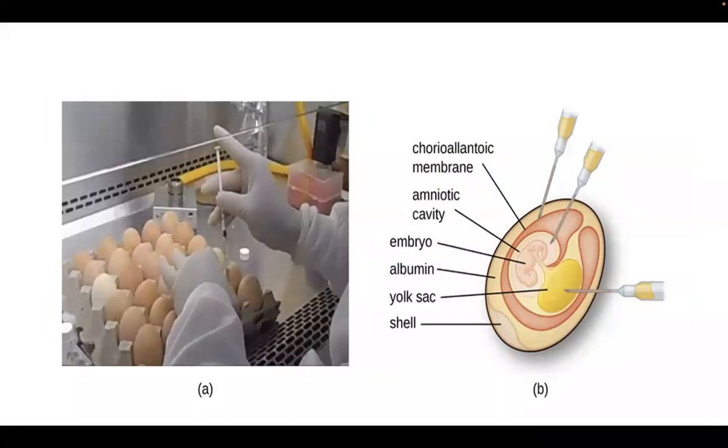So for some of us who may be interested in how the inoculation is ideally done, the egg with the embryo is first scanned or screened for the presence of an embryo. And then someone who's an expert in inoculating the various viruses onto the different sites does the inoculation by drilling a hole, and then the inoculation is done on the specific site.